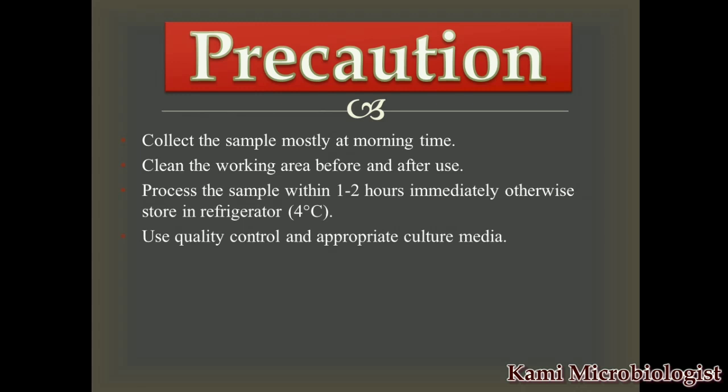Next, you must use quality control. This quality control is important because it will give us an idea about your handling, and also whether the culture media that you are using is good or not. For quality control, you must use a positive growth, such as Pseudomonas, and also a negative control which doesn't contain any bacteria.